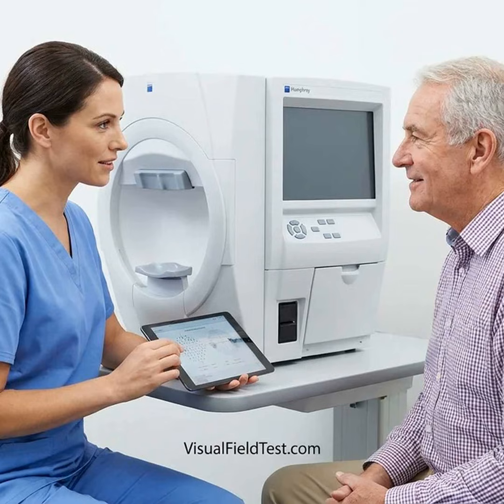A practical structured coaching protocol. A clinic can provide structured coaching in approximately 5 to 8 minutes. Step 1. Set expectations. Use simple language. This test measures how sensitive different parts of your vision are. You will not see every light. Missing some lights is normal. This reduces the fear that a patient must respond perfectly.